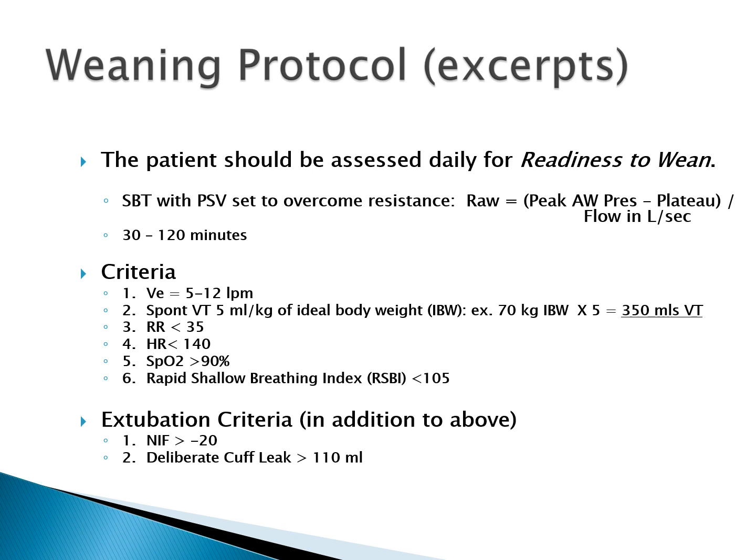Now we're going to pick up the pace in the presentation a little bit and just take a look at some excerpts from weaning protocols. They're not the actual protocol itself, but these would be critical elements. Patients should be assessed daily for readiness to wean. So a spontaneous breathing trial using mainly pressure support or another mechanism such as tube compensation, again 30 to 120 minutes.